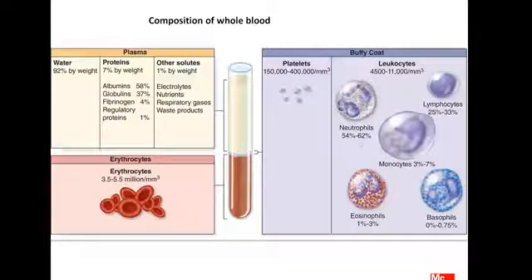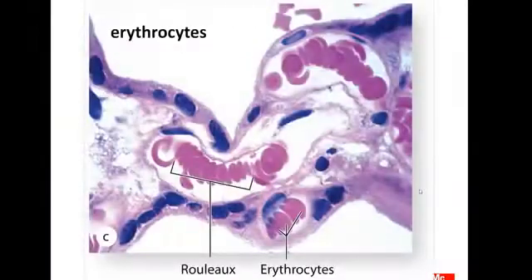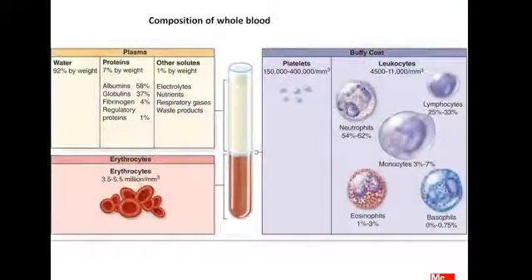In the eosinophil, it is a bilobulated nucleus, bilobed, bound by a thin thread of chromatin. While in the basophil, there is an S-shaped or irregular nucleus, and these granules are coarse blue granules.